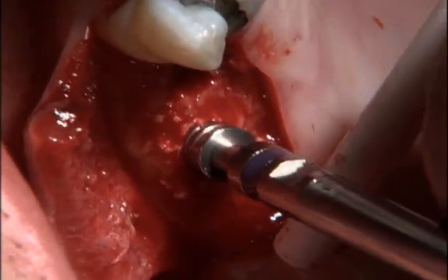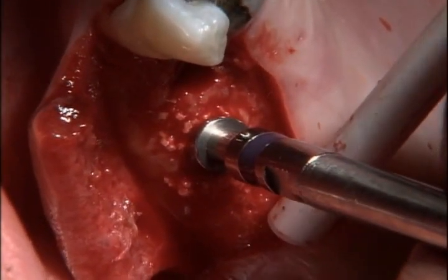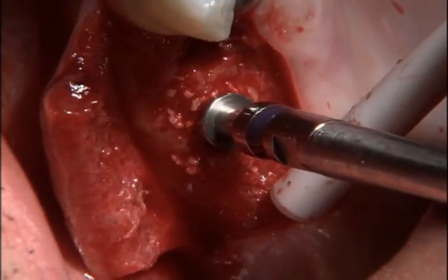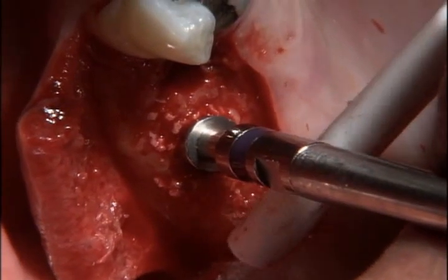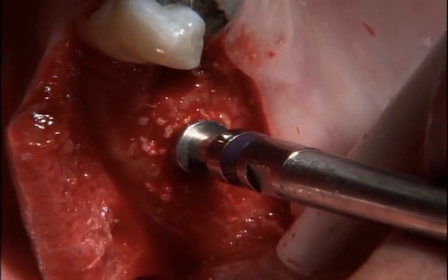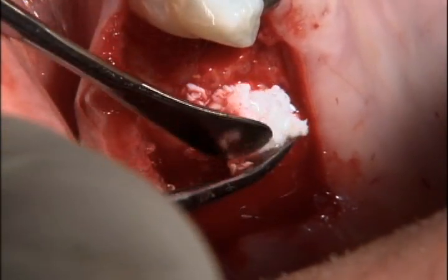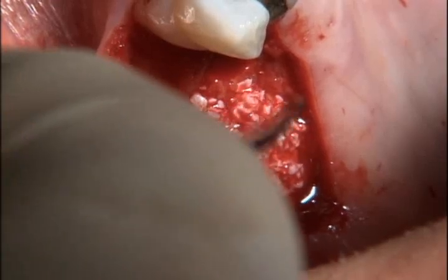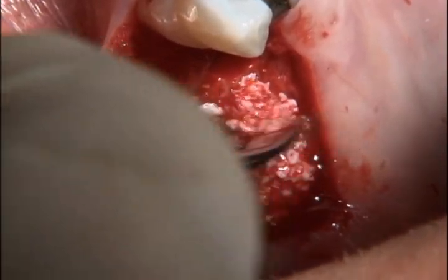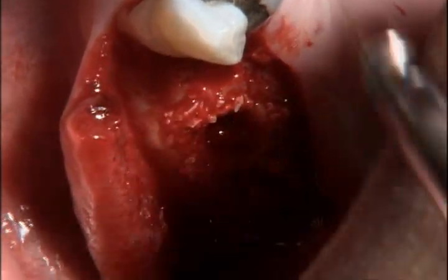Having added the graft material, the number 3 osteotome tip, or as in this case, the 7 millimeter by 4.1 millimeter diameter trial fit gauge, is reinserted into the osteotomy and advanced approximately 1 millimeter more in depth with the aid of the surgical mallet. Thereafter, the sequence of adding graft particles and advancing the osteotome tip or trial fit gauge by a further 1 millimeter in depth is repeated until the full depth of 7 millimeters is achieved.